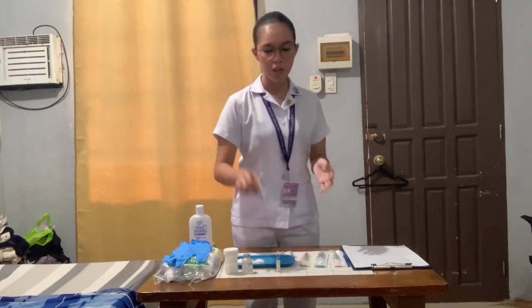Since this video will consist of three scenarios, which are the ID, the IM, and also the subcutaneous, I'm going to perform first the intradermal route. For the preparation, I'm going to prepare all of the medications needed for the patient. So first is for the intradermal.